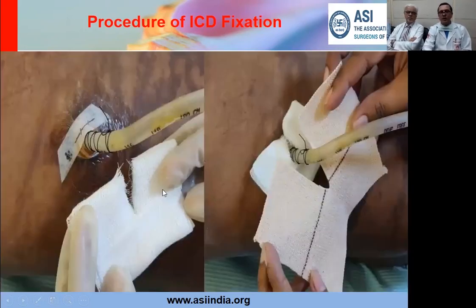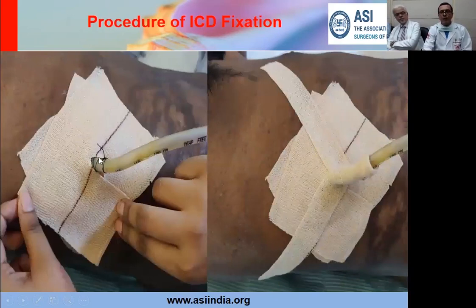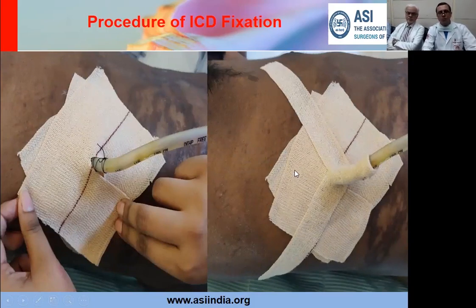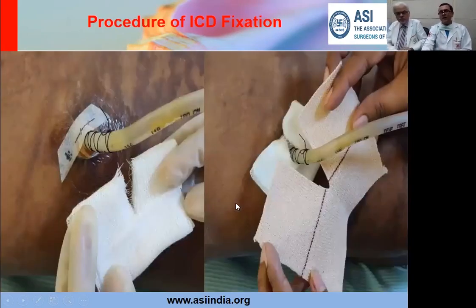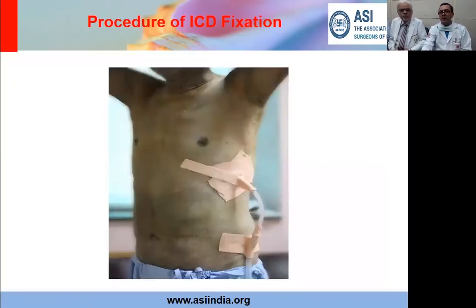Now I'll put a cut gauze piece around it, and then I put plaster. Half cut comes from one side, the other half comes from the other side, and you take a flat strip which could be going this way or going across. This will keep the tube anchored to the skin. Whether you use Dynaplast or Micropore or plaster, that's your choice. But it's important that you have an initial covering of a sterile dressing so that this area is going to remain sterile as long as this dressing is in place. It's a small but I think important step. And then we have the gauze piece and the plaster.